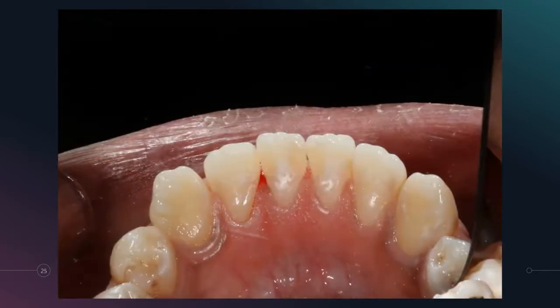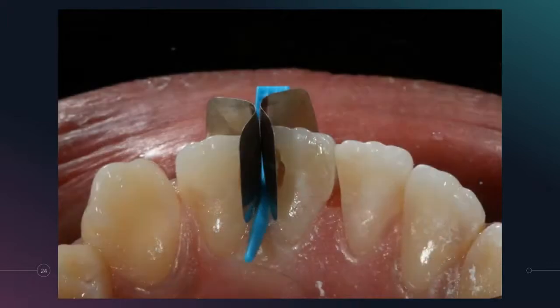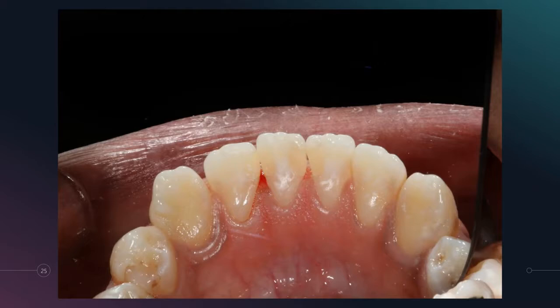And this is that situation fully restored. What I'll do here is I'll restore one, I'll take the band out just to limit the thickness that I'm trying to overcome with the matrix bands, and then I'll restore the other one, but I don't remove the wedge. I'll leave the wedge in place even as I pull that first matrix band out, and that's the final result we get.